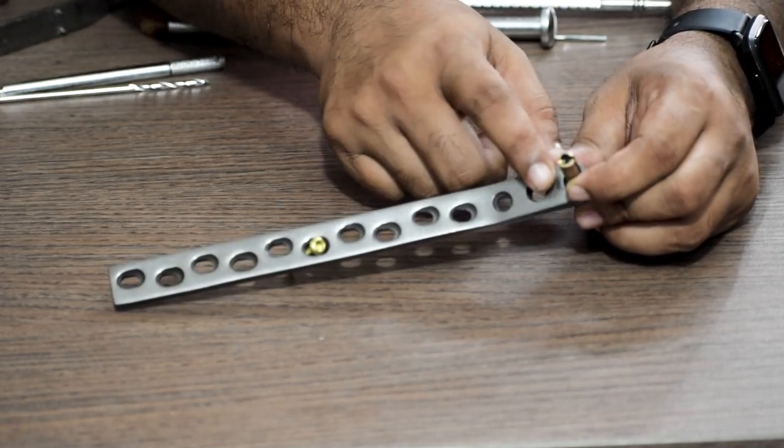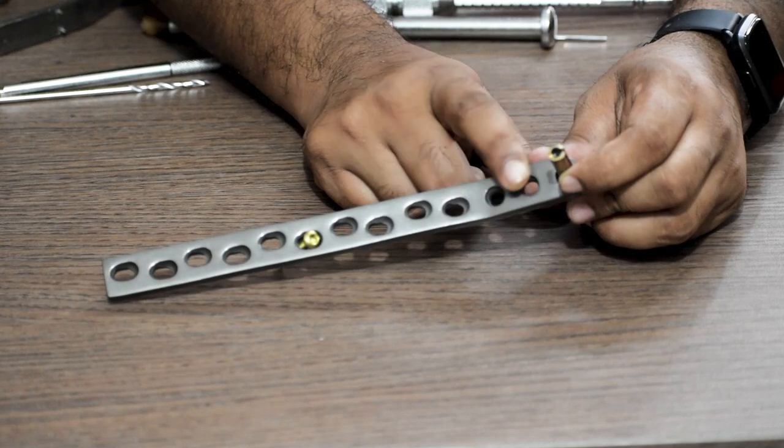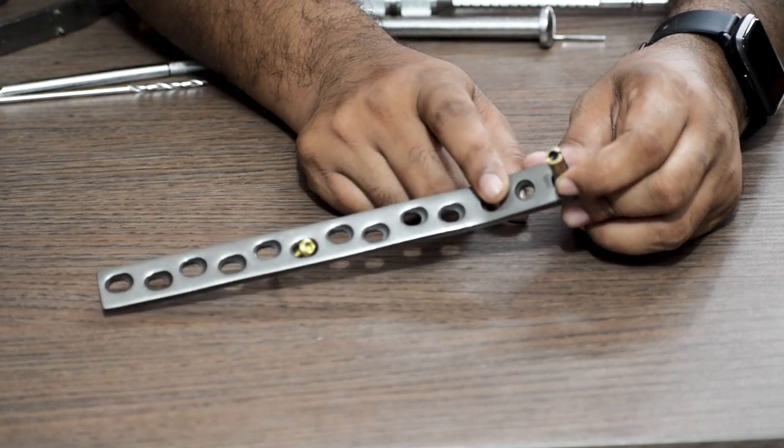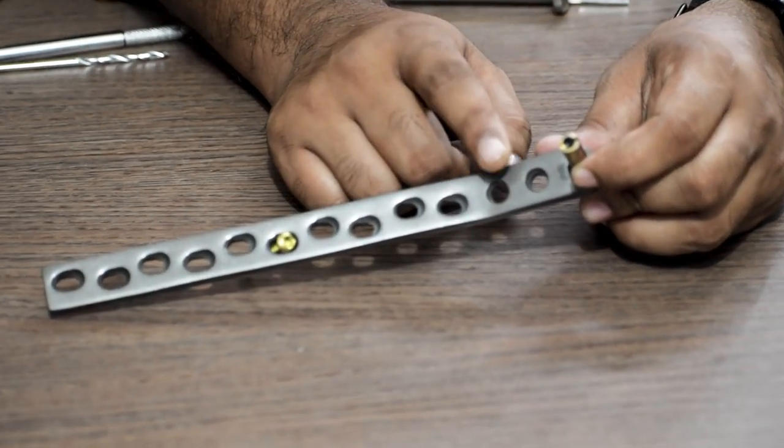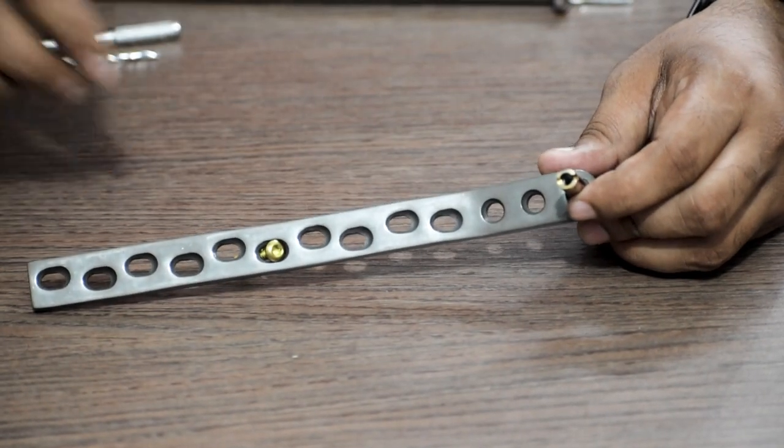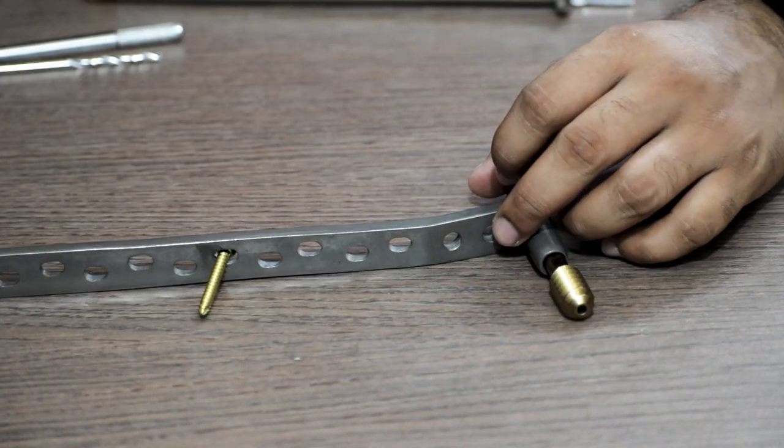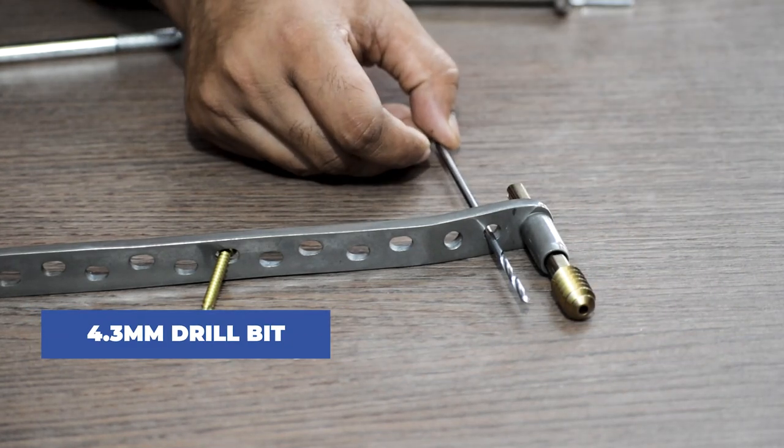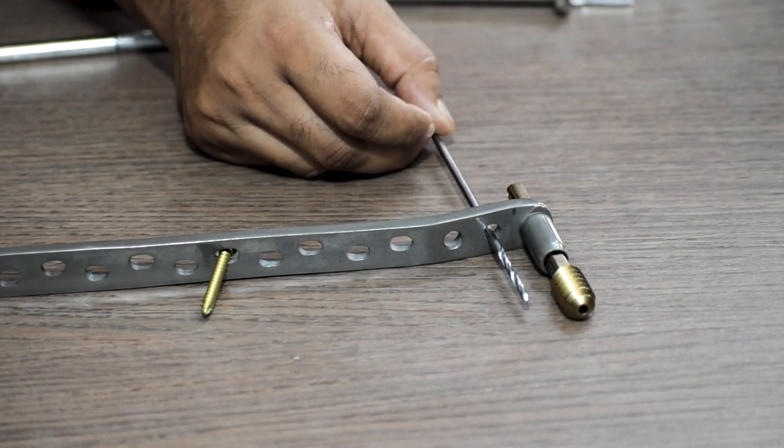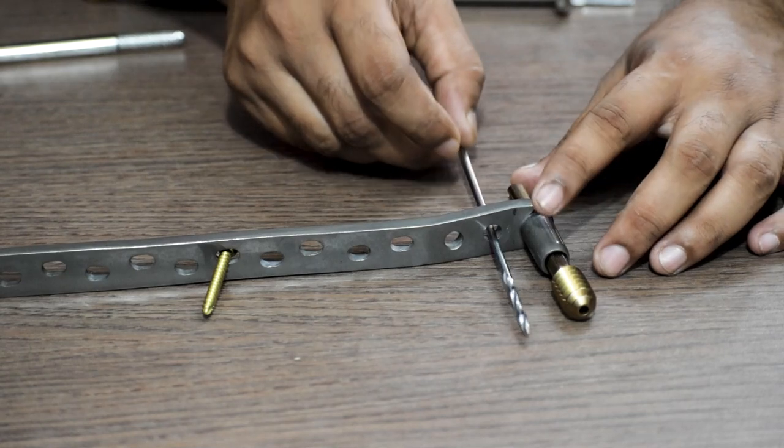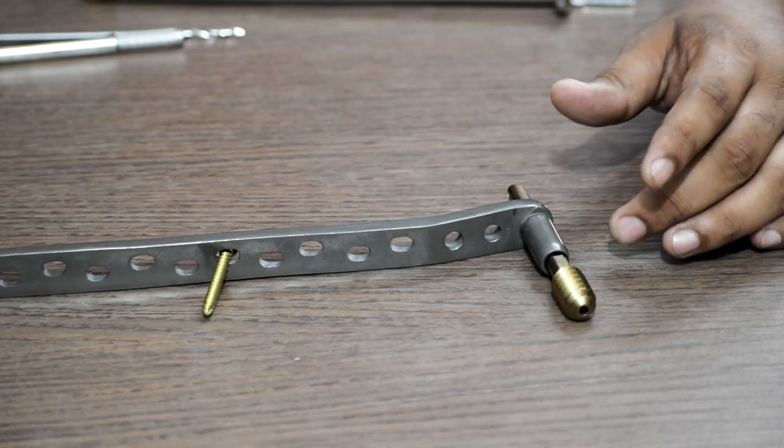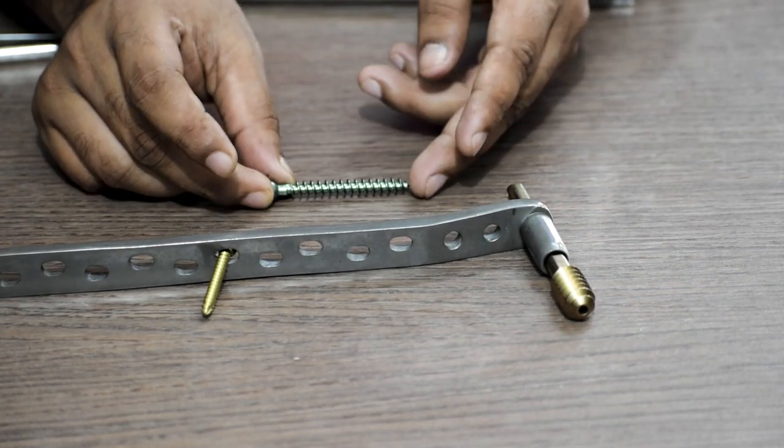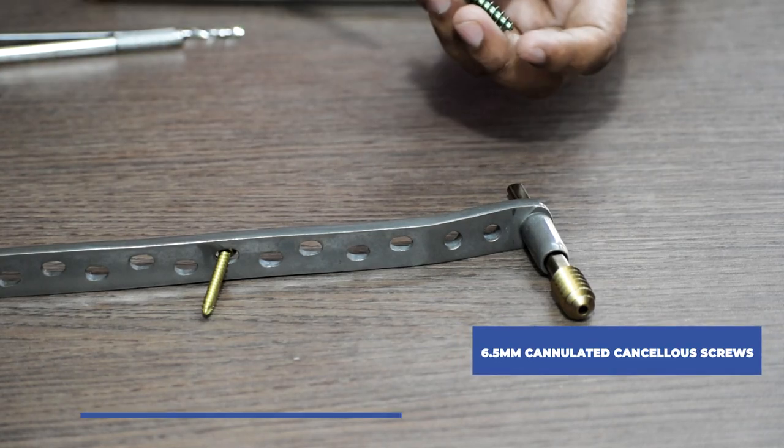These two holes are for 6.5 mm cancellous screw. Cortical screws are not fixed here. For that we use a 4.3 mm drill bit. Measure the length with the help of a depth gauge and take a 6.5 mm cannulated cancellous screw of the measured length.